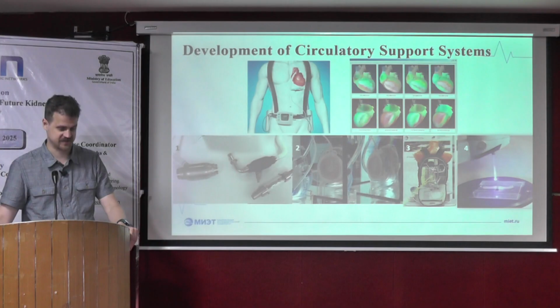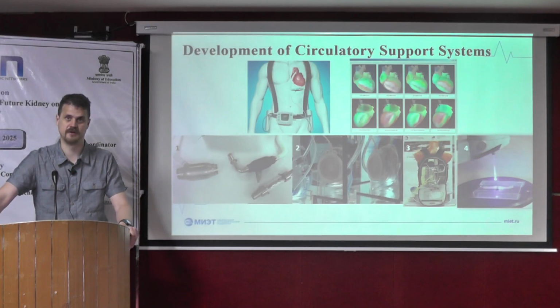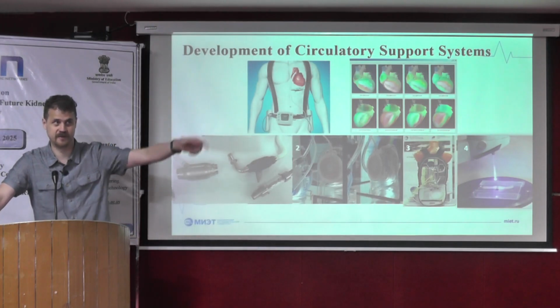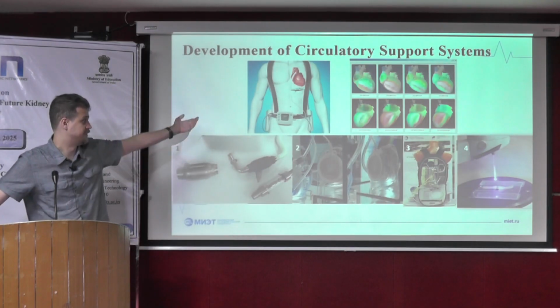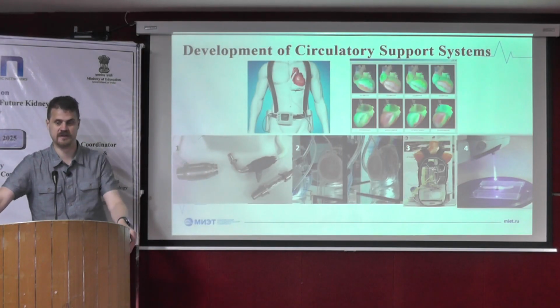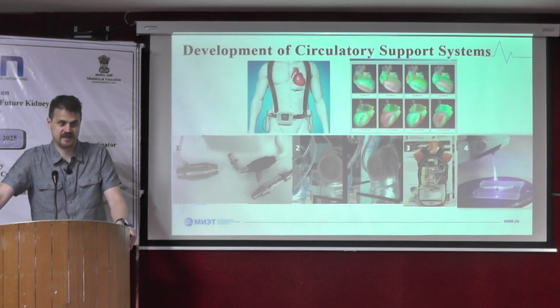a correct answer. So we have to consider a type of anticoagulation surface that will prevent the mechanism of the clot formation within the internal surface of the apparatus. In terms of the heart, it's of course the pump itself, and in terms of the implantable artificial kidney, it's different microfluidic systems that provide the initial blood filtration.